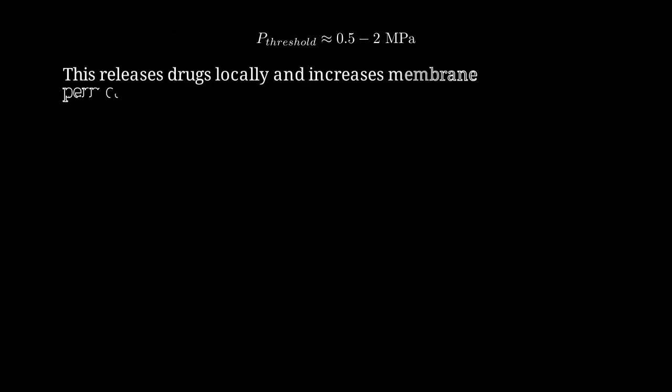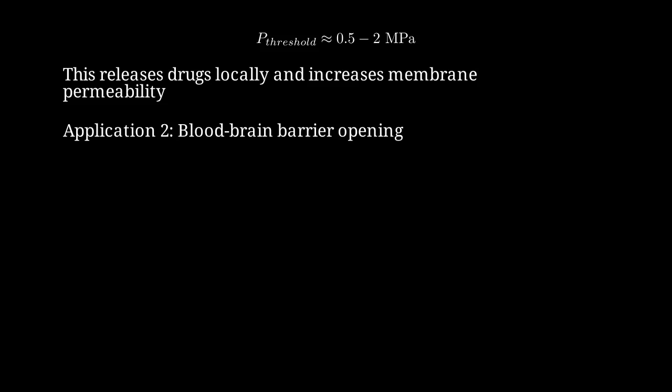Bubble destruction releases the drug payload locally and creates temporary pores in cell membranes, enhancing drug uptake. Second, focused ultrasound with microbubbles can temporarily open the blood-brain barrier for drug delivery. Blood-brain barrier opening requires careful parameter control. Pressure of 0.4 to 0.6 megapascals at frequencies 0.5 to 1.5 megahertz.